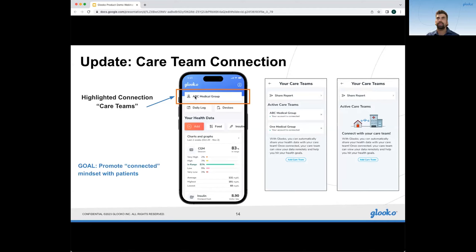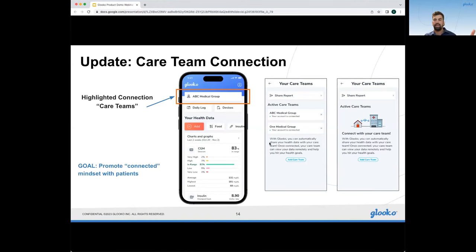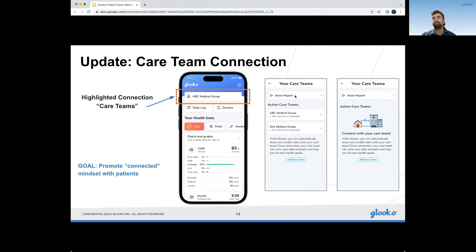Another update is highlighting the care team connection. When you invite a patient to Gluco from your HCP portal and they activate through the invite email or the QR code printout, and they create a password through the email sent out, they're automatically pro-connected to your clinic. Any data that they sync here gets sent to your portal for you to view. Any data previously synced in the clinic will be waiting for them when they access their patient account at home. Patients can also manually share reports and have a list of active care teams if they're connected to more than one site.